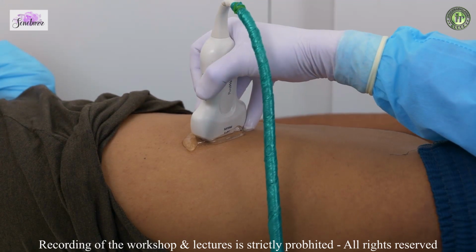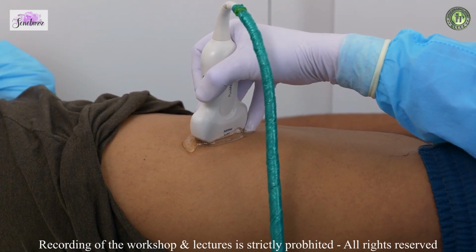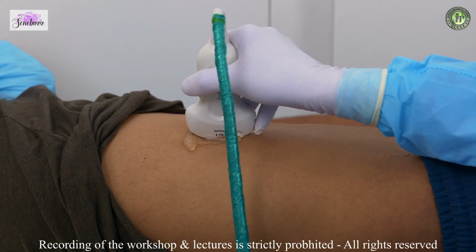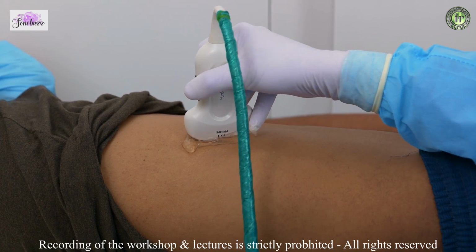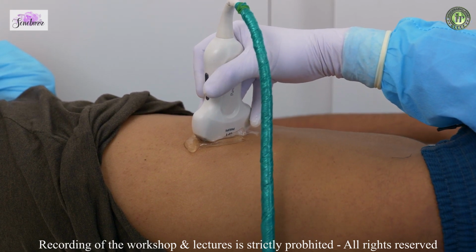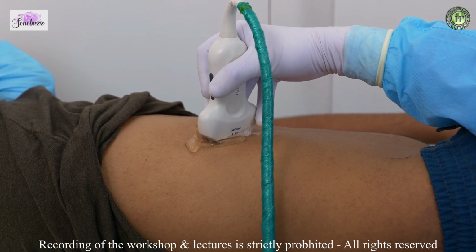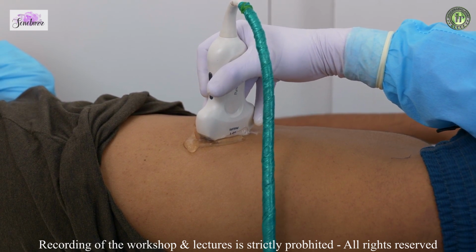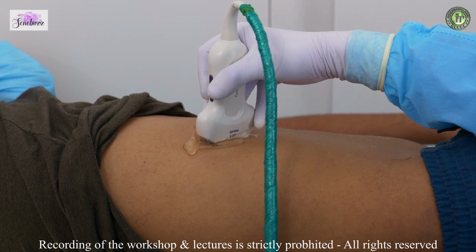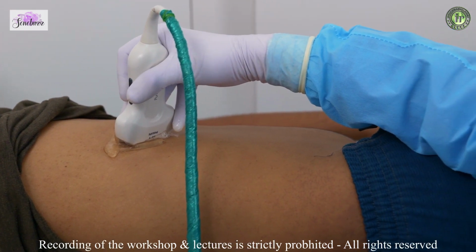So when we start scanning, like I mentioned before, we have to go in the intercostal space, because you do not want to scan obliquely. You do not want the rib shadows to come into your B mode image. You have to go in the intercostal space. Remember one thing, the essence of getting a good elastography reading is getting a good B mode image. If you do not have a good B mode image, you will never ever get good elastography values. So that is how basically we position our probe.